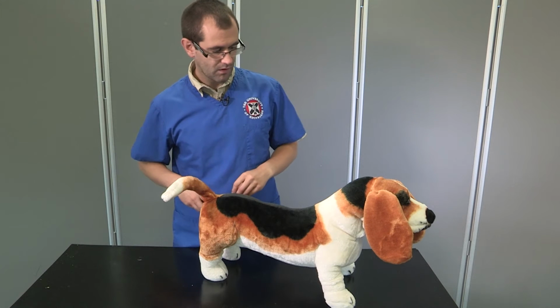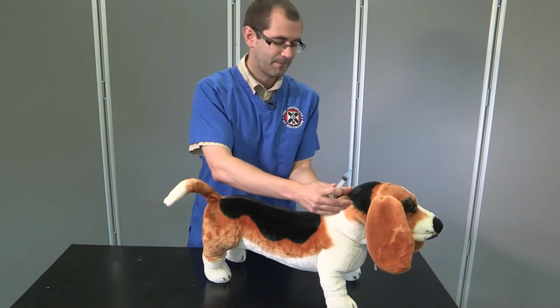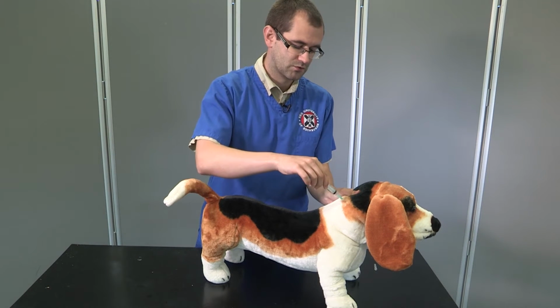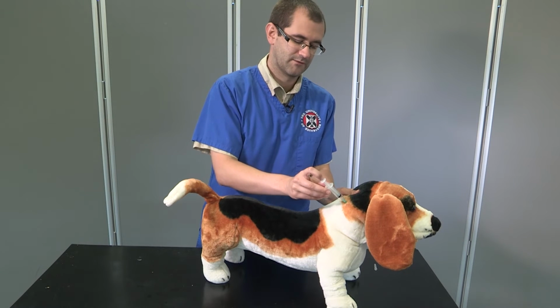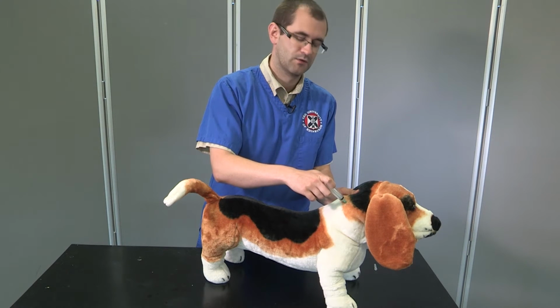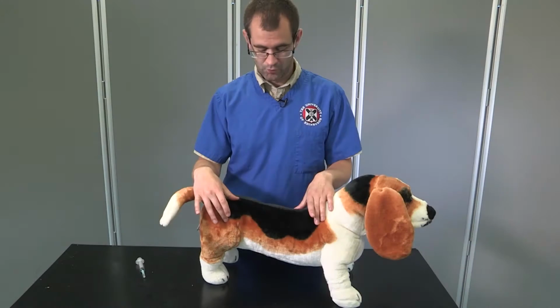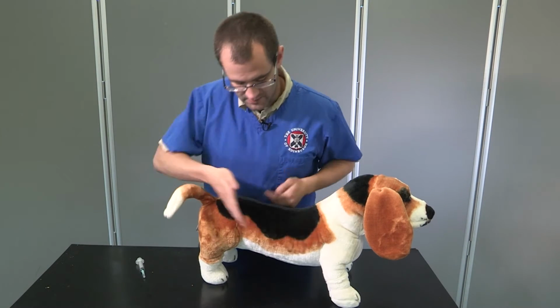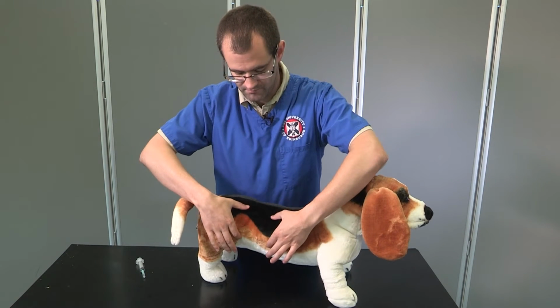All we will do is take our needle and syringe, palpate the neck to ensure you're in the muscle body, introduce a needle, and then draw back to ensure you're not in a blood vessel, and then slowly inject your drug. Withdraw.